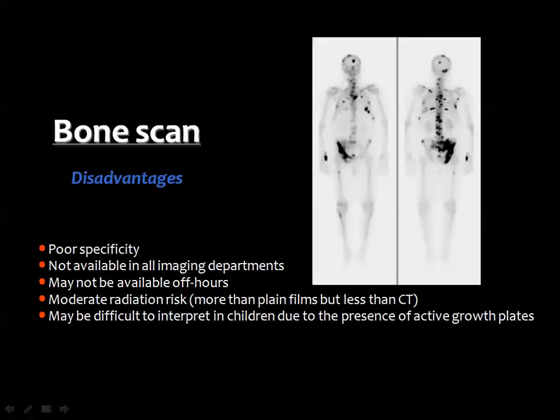Also, the detection of metastatic disease is easy by bone scan, but consider the non-specificity or the poor specificity of this machine. Also, the bone scan is not available actually in all imaging departments, and it cannot be available for 24 hours.